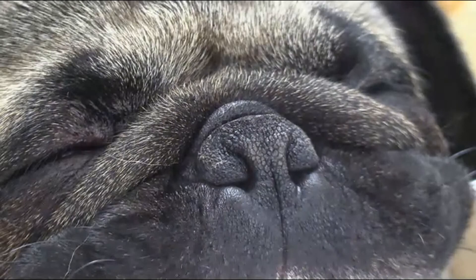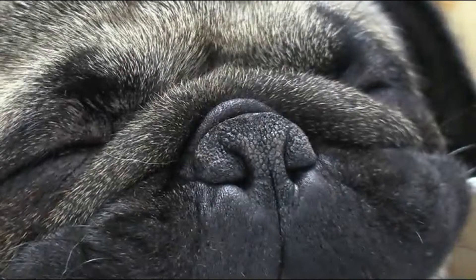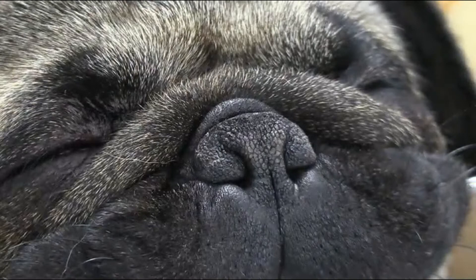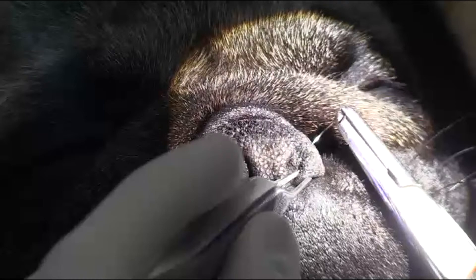Hi guys, this is Charles and I'm one of the surgeons at Southpaw's. Today we are doing another brachycephalic airway surgery in a dog. I'm going to start doing the conventional wedge alar plasty and then I'm going to do a folded flap palatoplasty, and I'm using coblation to get rid of the residual or redundant soft palate, which is a little different from the way you might have seen in the past.